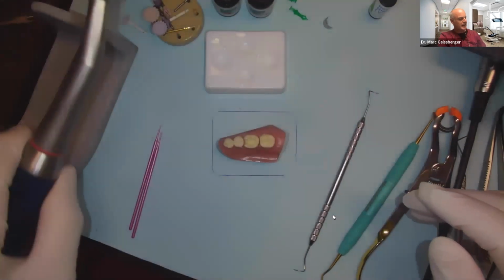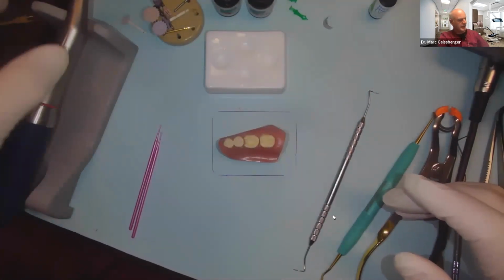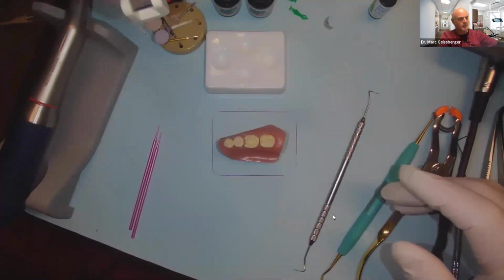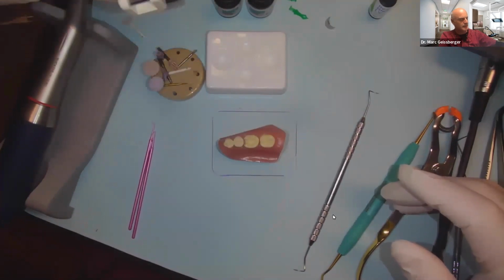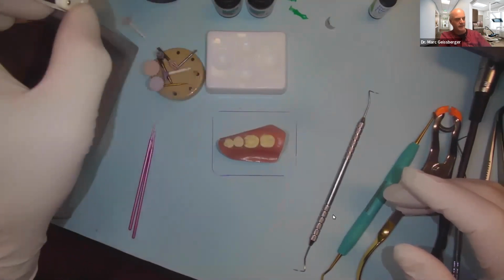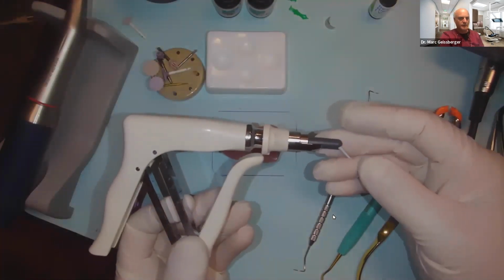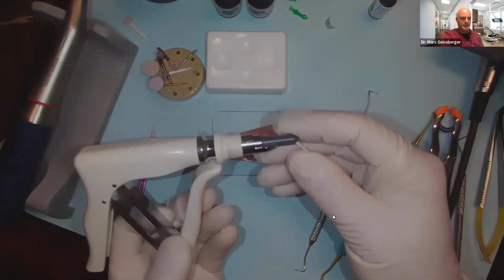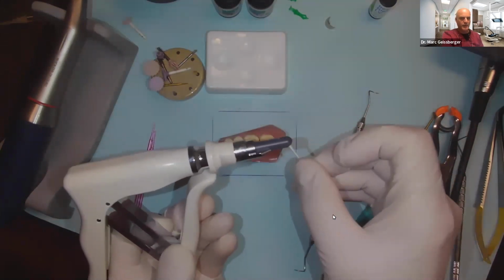In addition to that, I have my handpiece. This is a product I use from NSK. And right here off screen, but I'm going to pull it on screen for just a moment, is my composite warmer. And I've got the composite warming to 155 degrees. I've got my gun preloaded with the flowable composite Evanesce Flow. And the really cool thing about this is I can change the angle of the tip by 40 degrees.